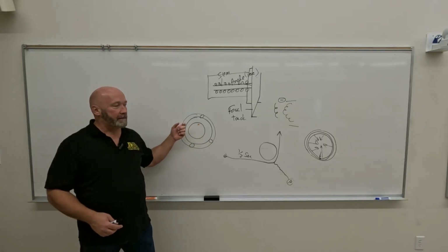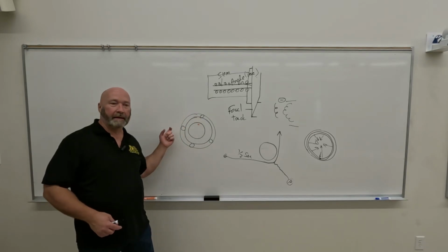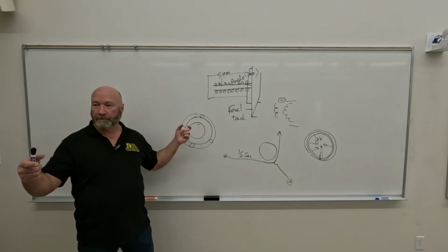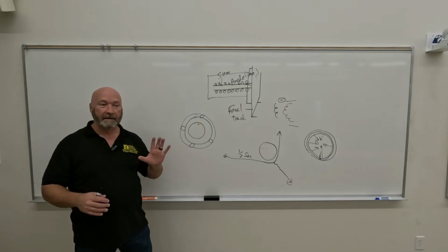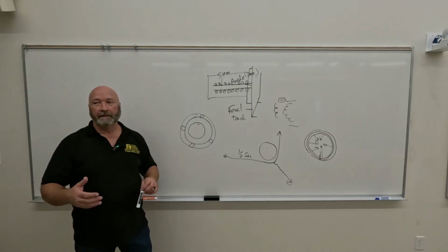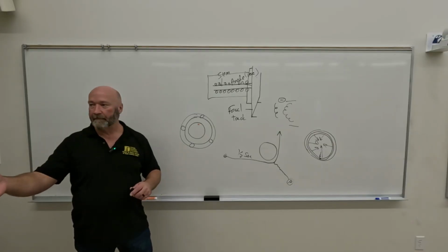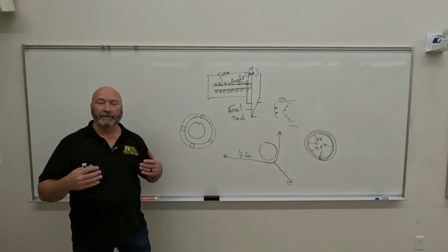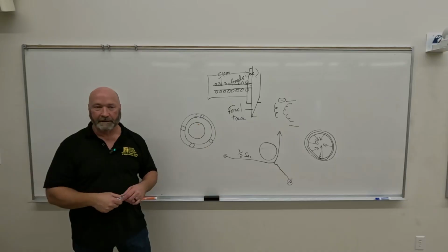But what happens after you make your exposure is the induction motor kicks back in and it fires in reverse order to take you from that 3,400 RPM back down to 0. Okay, and most of the time that's going to happen within 5 seconds. So you make your exposure and you'll hear one beep and then you'll hear possibly a second beep whenever the rotor stops. Okay, and if you don't hear the beep, generally you can hear the end of the rotation.